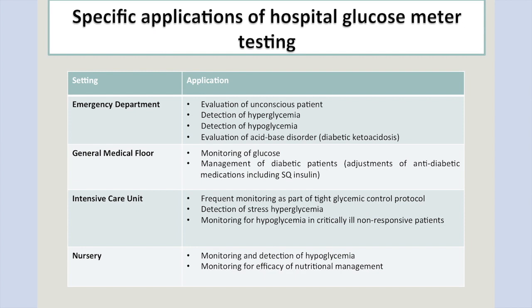But in the hospitals, and this is where I'm going to get up on my pediatric or NICU soapbox, we have the other issue in NICU. In NICU, we need to accurately identify our babies who are truly hypoglycemic, and that's going to occur in babies within the first couple of days of life.